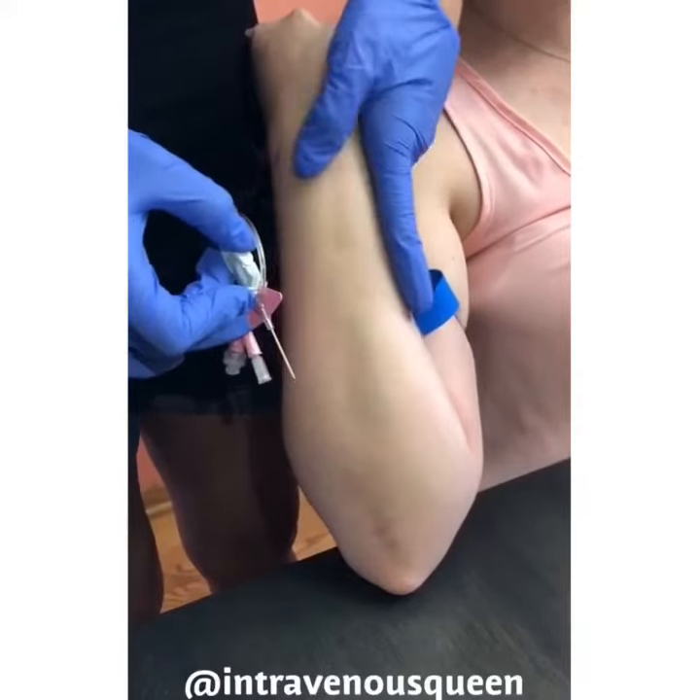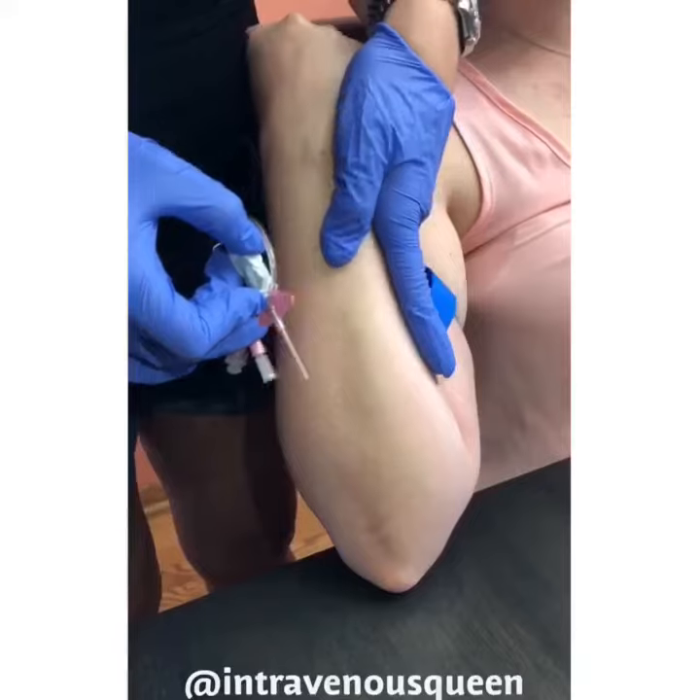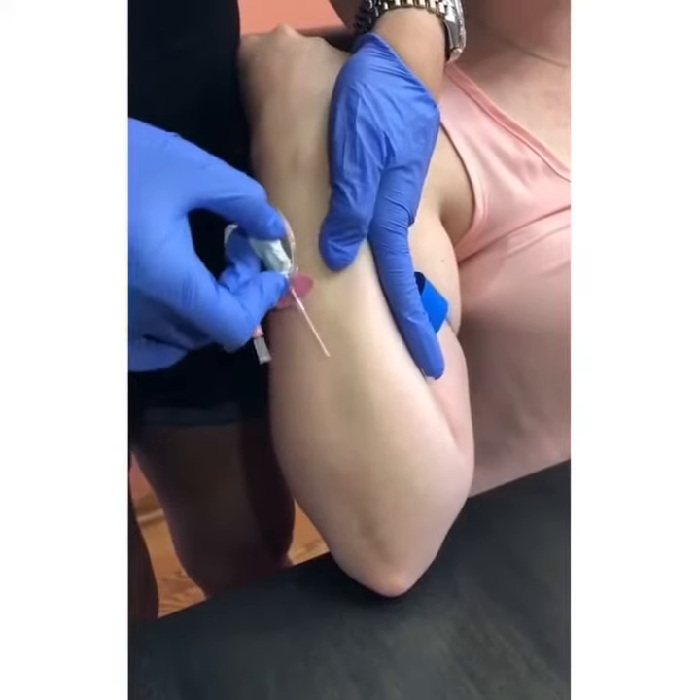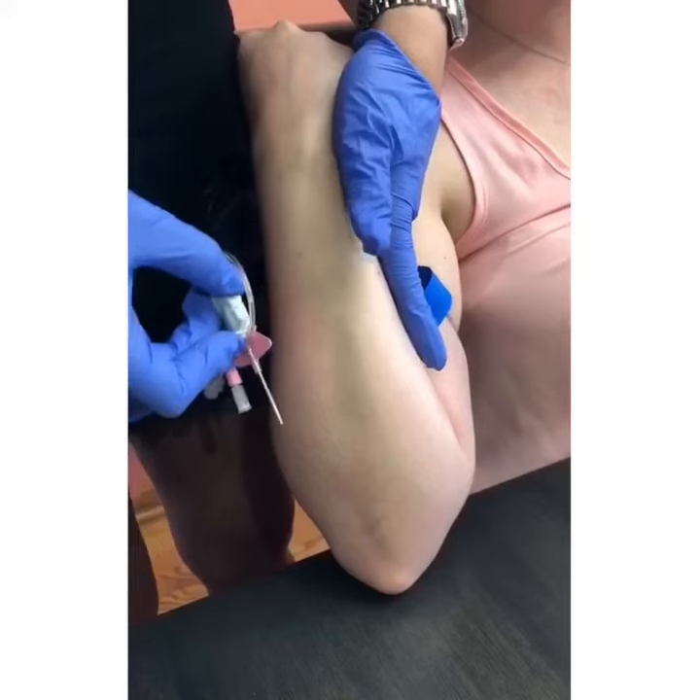Taking your left hand, use your thumb to pull the skin downward towards you to help tighten the skin. This will make the insertion much easier as the vein is less likely to roll.